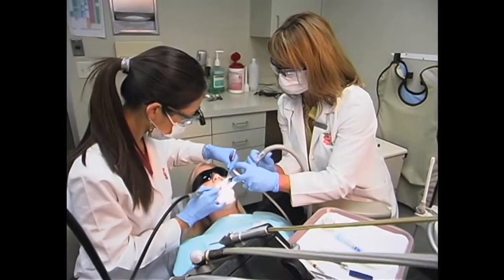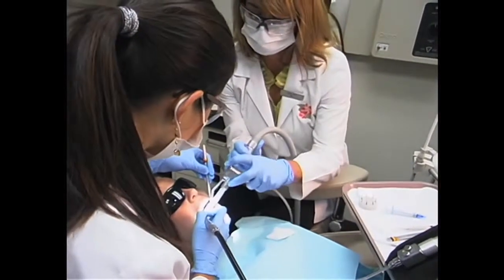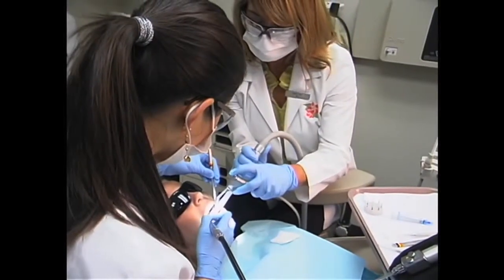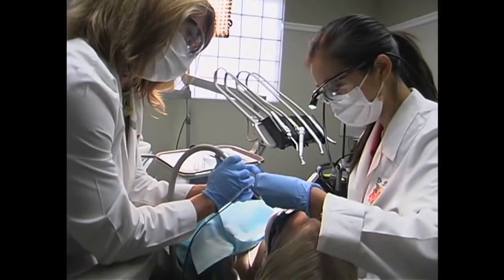We definitely have a lot of kids who come into our practice who are very scared of the dentist. In the past, they've probably been to a pediatric dentist or a dentist who has not had the WaterLase in their practice, and because of that, they've been very fearful — they've had a shot at these dentists who did not have the WaterLase. So whenever they come to our practice, we use the WaterLase to do all of our fillings, and that eliminates the shot completely, giving our patients a really positive, fun experience.